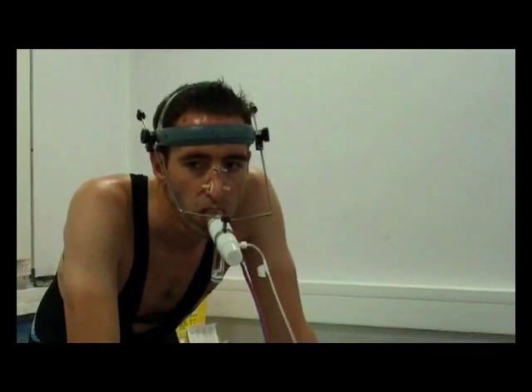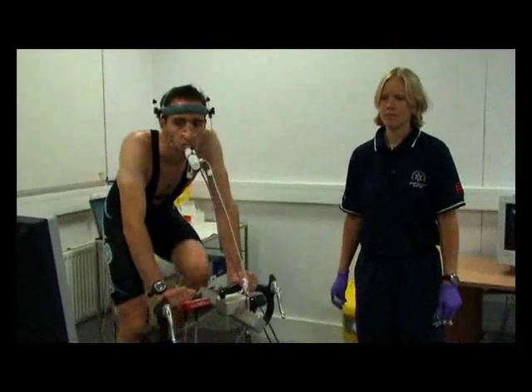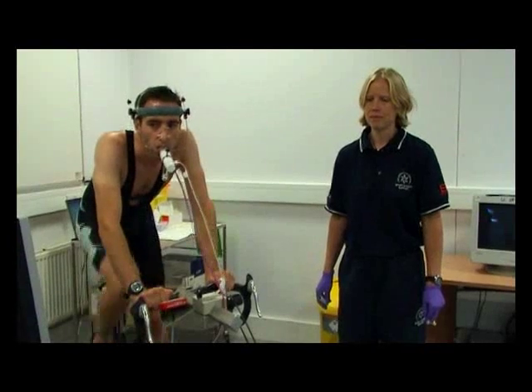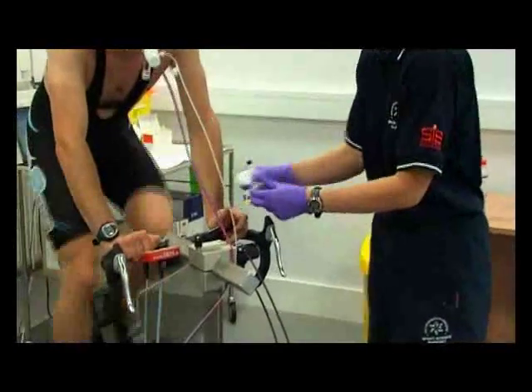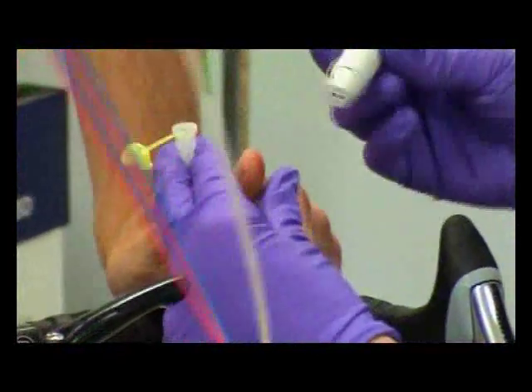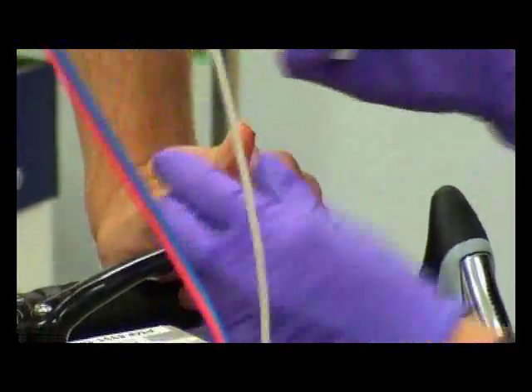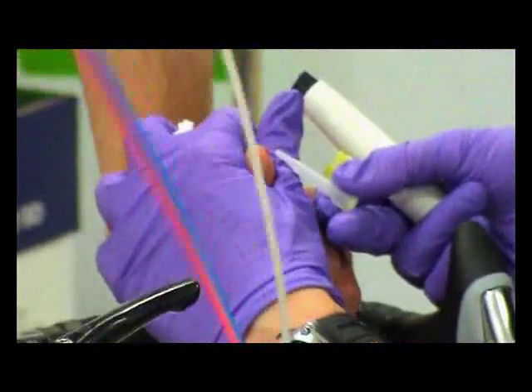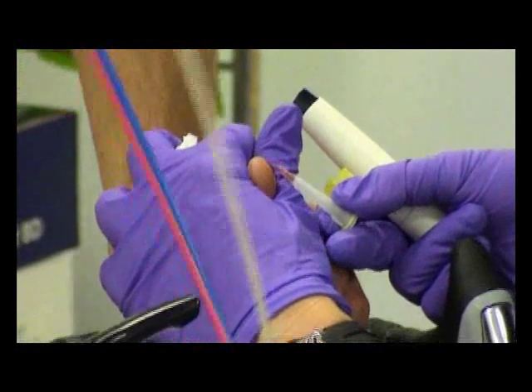Our cyclist is still going. He's now reached 220 watts. Time for the next sample. During these collections, we have to be quite careful not to squeeze the thumb too hard, or else we can destroy the red blood cells.